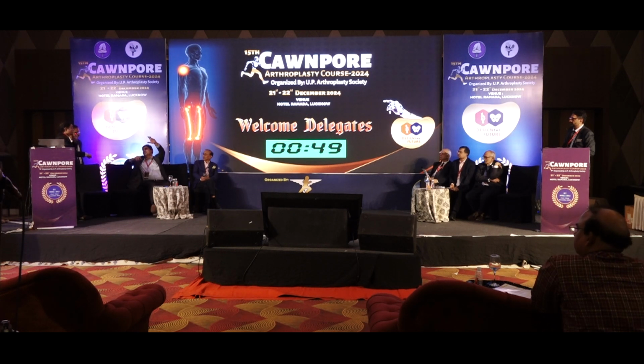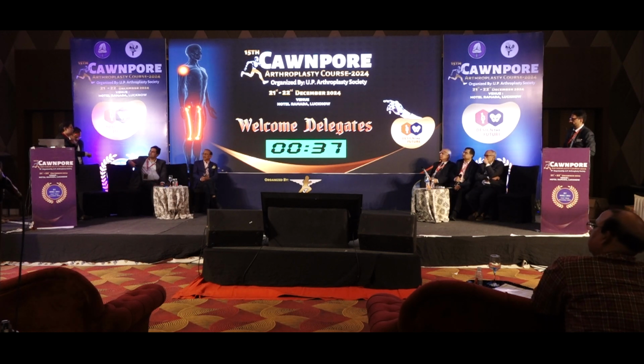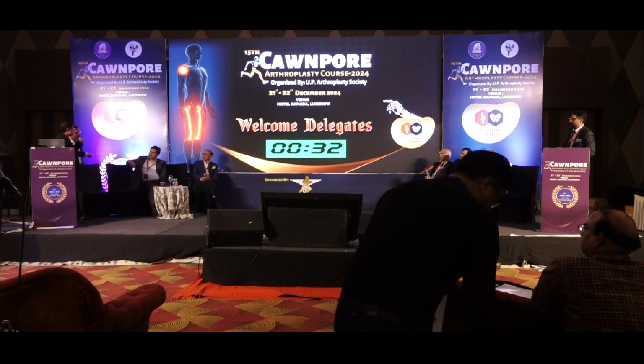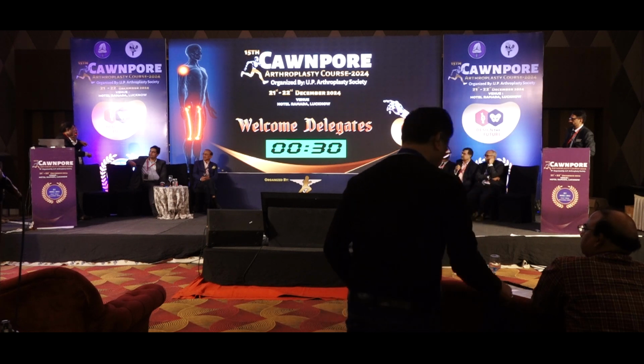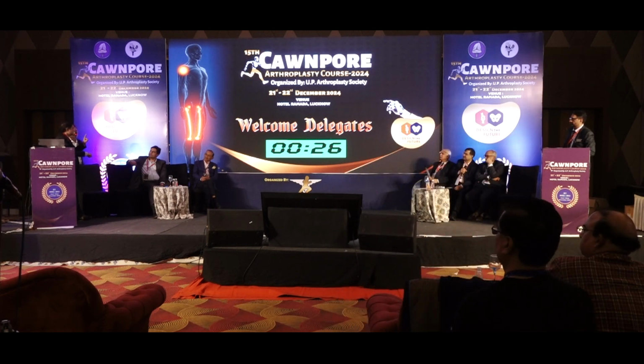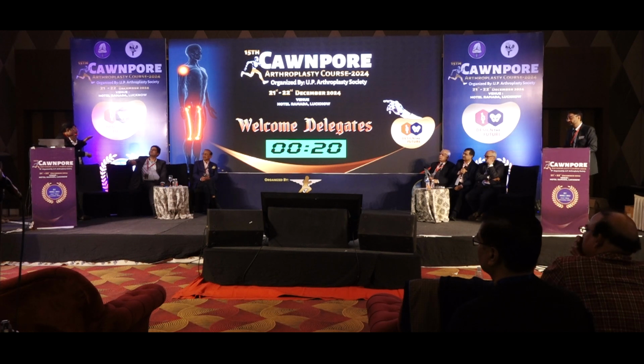What I'm saying is a UC insert not for all cases. I'm saying if required, you can always go from a CR to a UC insert. Now you have that option with you. So my practice is if I'm doing anything with the PCL, I tend to put a UC insert. And you should know your implant. The Attune, for example, only has one insert internationally for CR. There is no UC insert in Attune. And they claim that it's more conforming and it gives you the function of the same thing.